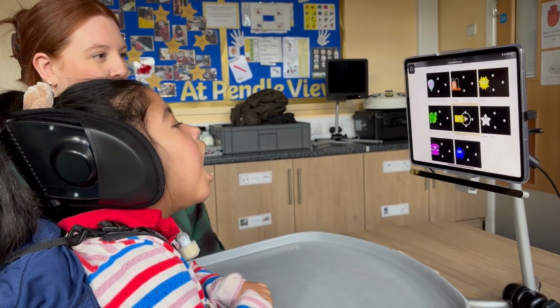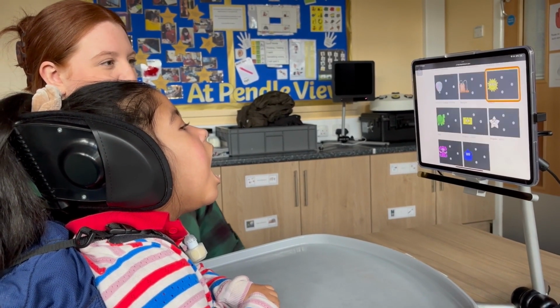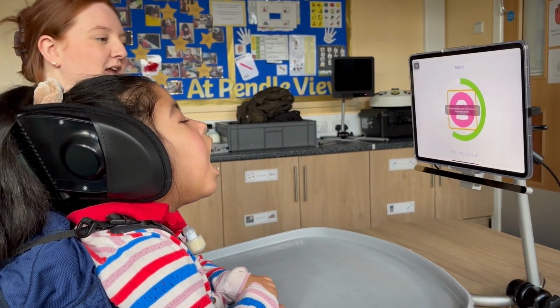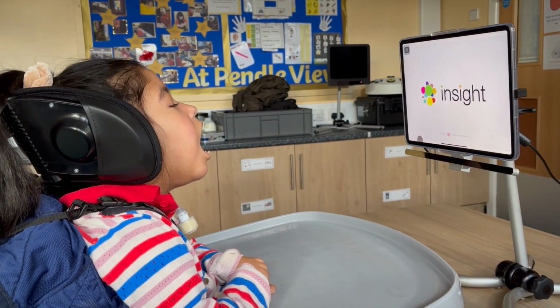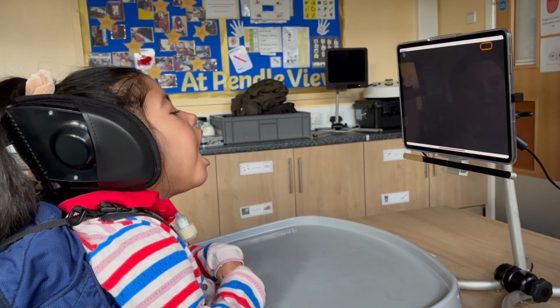As you can see, unfortunately, Husna is hitting the assistive touch menu there, provided by the iPad. You can't make that disappear as such, but as the teacher showed, you can move it across to the other side of the screen, so maybe that won't be so much of a distraction.